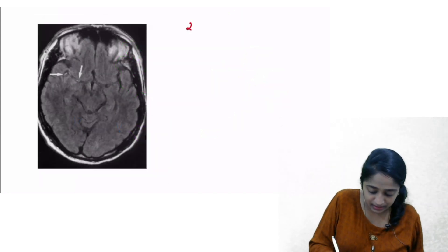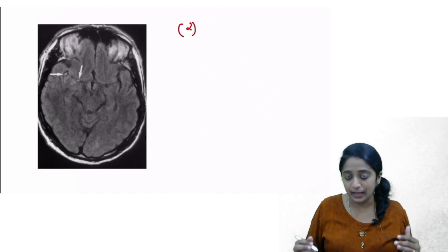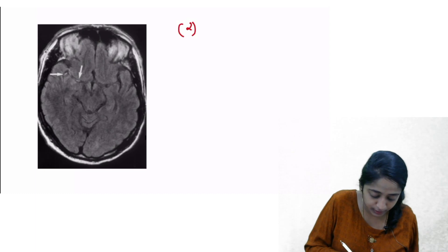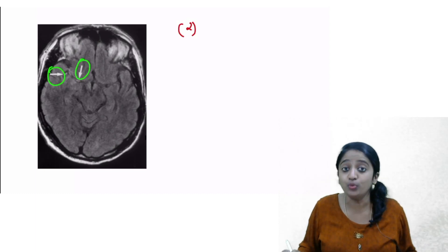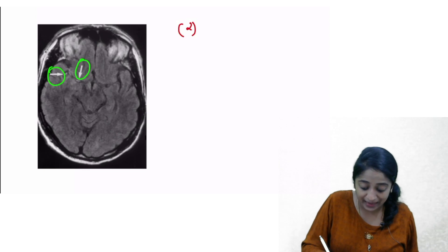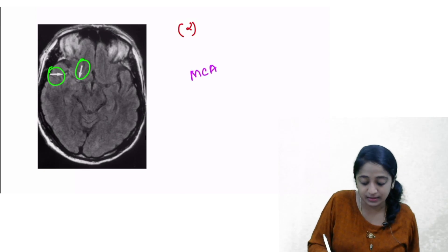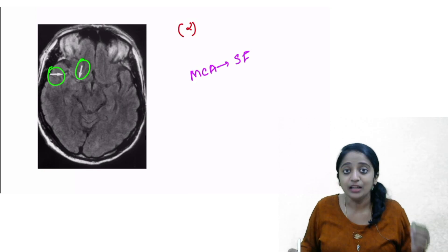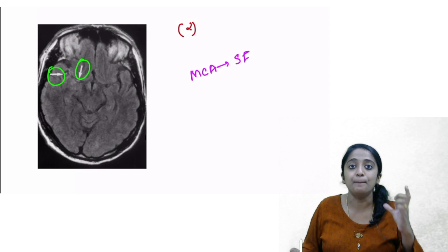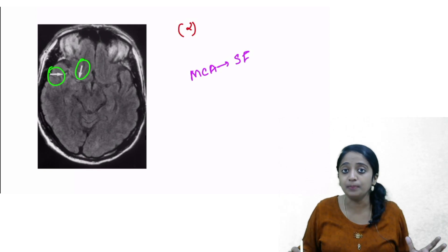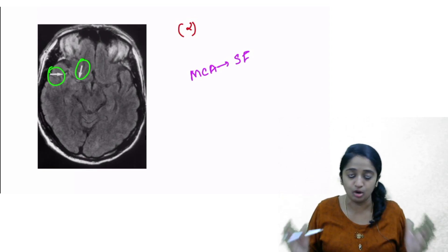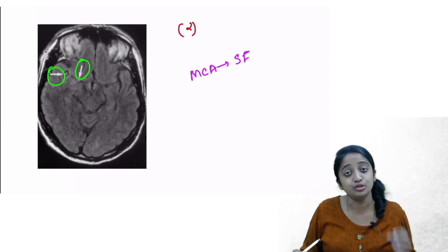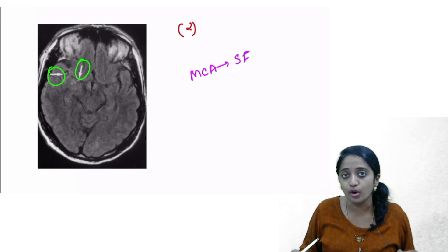Now let's look at the second sign. Again, given a FLAIR image — looking carefully, you can see arrows marked toward the sylvian fissure. What runs in the sylvian fissure? The branches of the MCA run in the sylvian fissure. How do normal vessels appear on FLAIR sequences? They should appear as signal voids — black areas. All intracranial vessels should appear as flow voids or black areas.